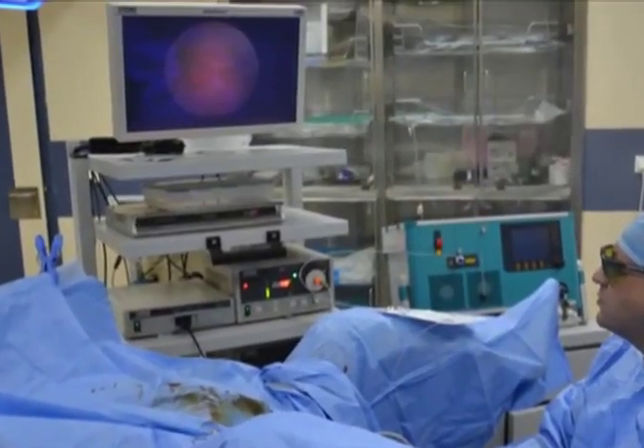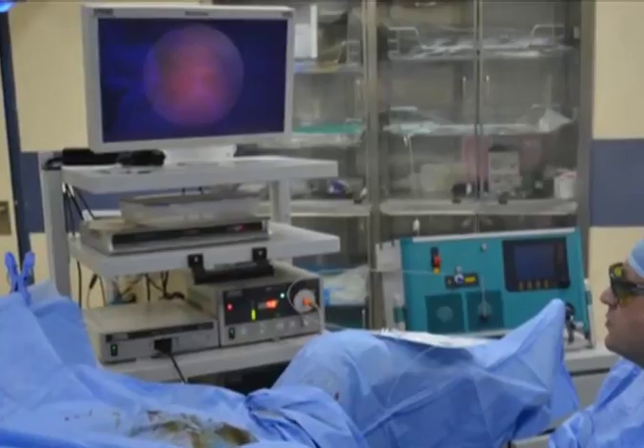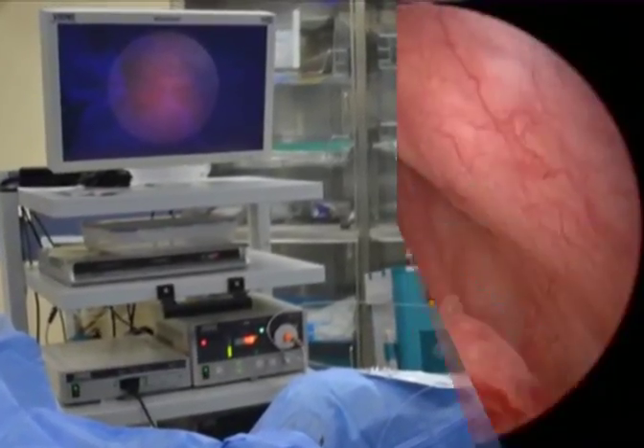This procedure is performed in a lithotomy position. The use of an endocamera and protective goggles is a must.